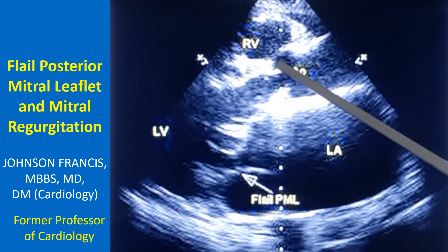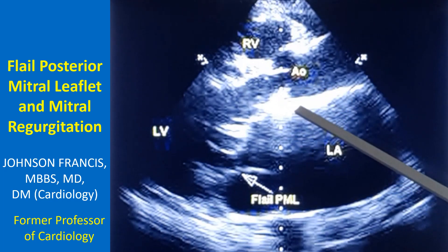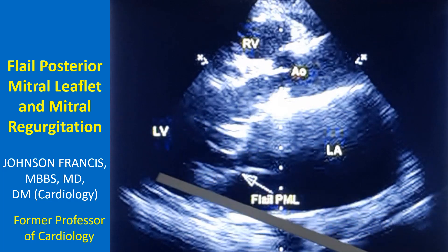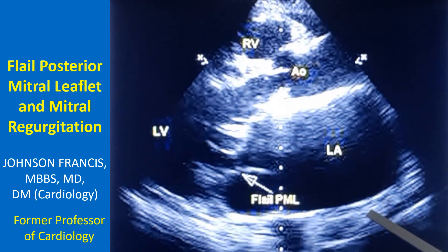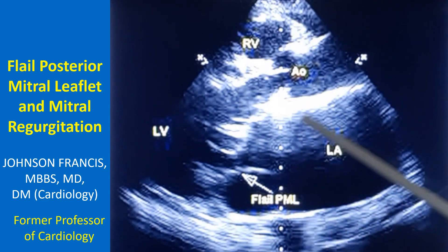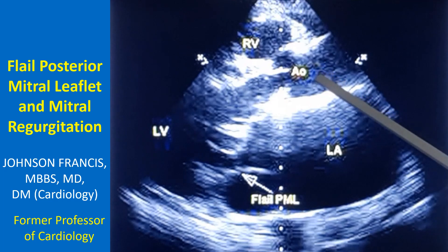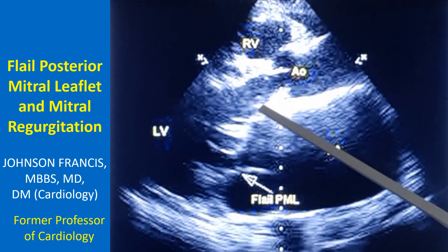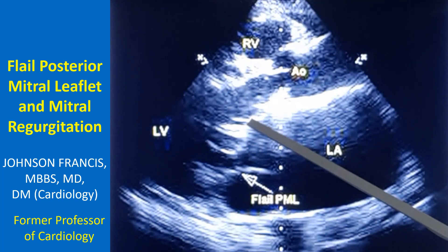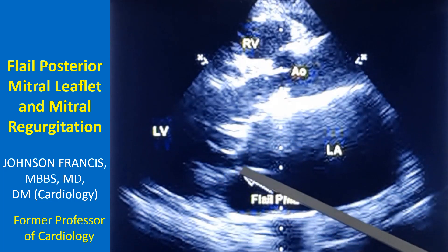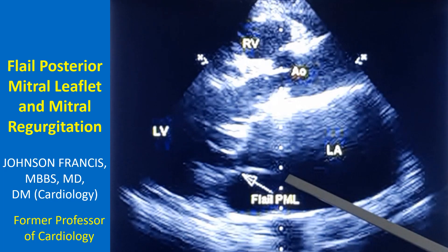Two aortic leaflets are seen in an open position. This is the left ventricular cavity, left ventricular posterior wall, left atrial posterior wall, and the descending aorta — cross section of the descending aorta. This is the ascending aorta. The anterior mitral leaflet is seen here in the closed position.